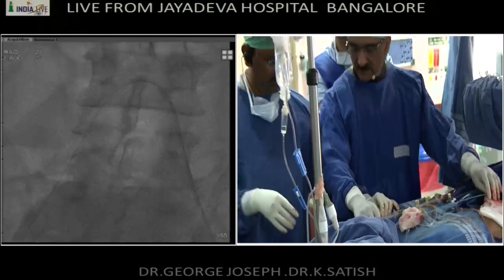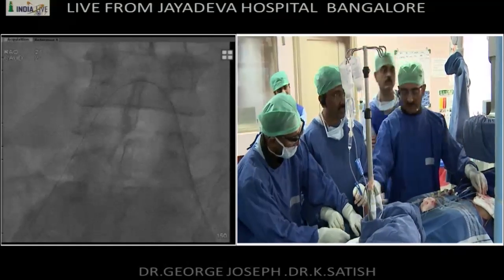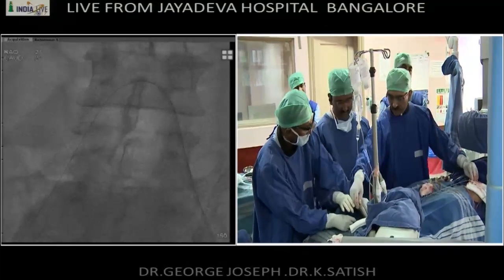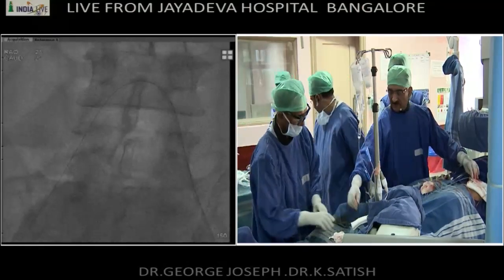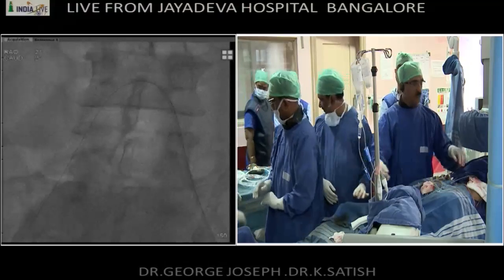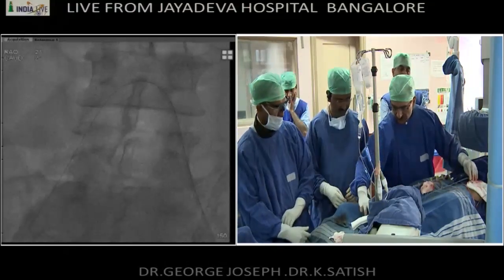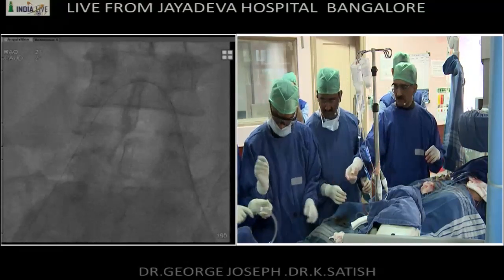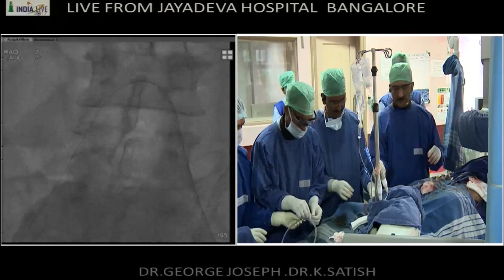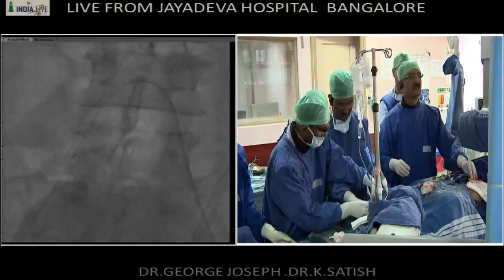You could use this itself, or you can do one thing: we'll pass a thermo first on this side and then we'll take the catheter out. We'll leave the wire there. Get a thermo please. I already have a 6F Cordis on the left side, so I will use that to send a thermo up. Thermo wire? Yeah, remove it. Let it bleed. It's okay. It's just a few seconds.